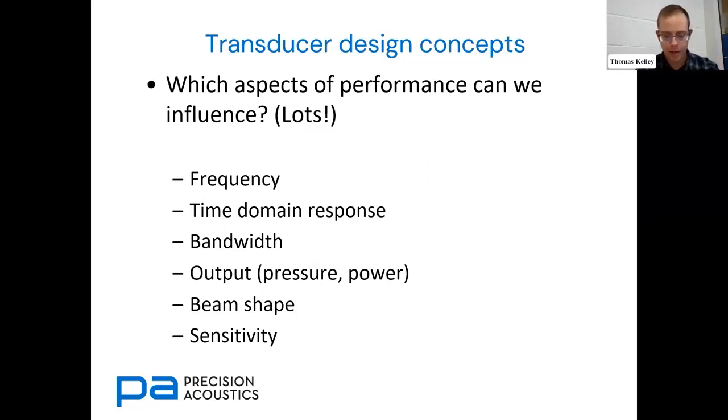So on that note, I guess a really key concept in the design is that all aspects of the design are connected. If you change one aspect of the design, it will influence some, one or all of everything else. So you can't change one thing in isolation.